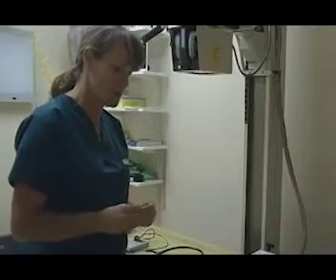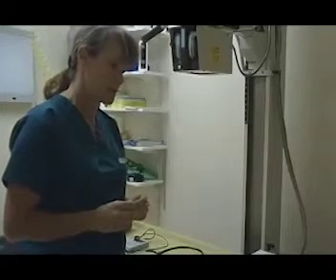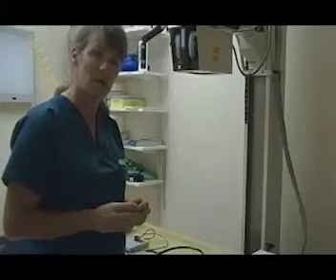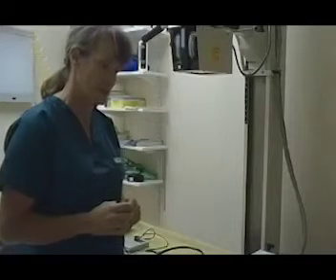All of these areas need to be monitored every 5 minutes in a physical status 1 and 2 patient, and documented physical status 3 through 5, and those patients that have been under anesthesia for 45 or more minutes should be monitored consistently to assure safety of the patient.